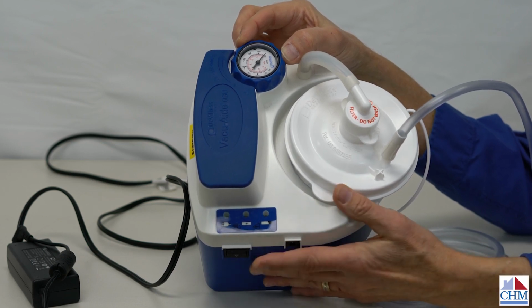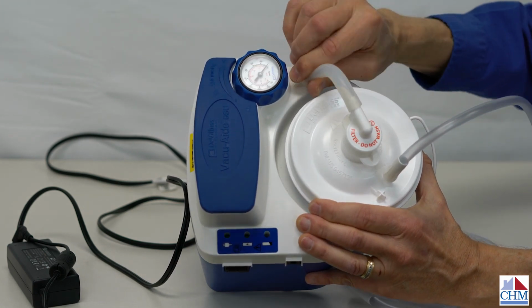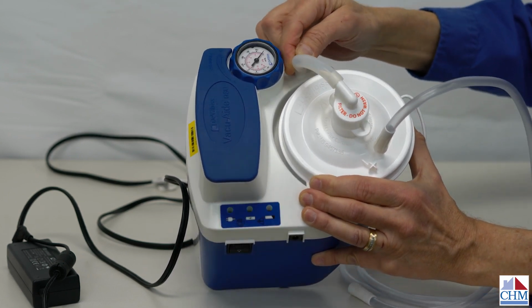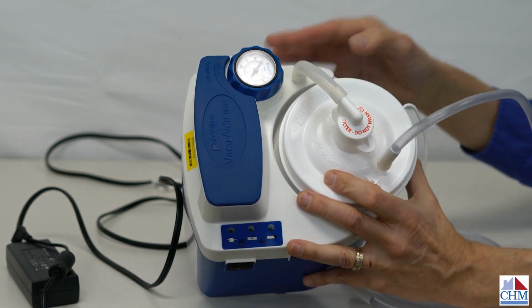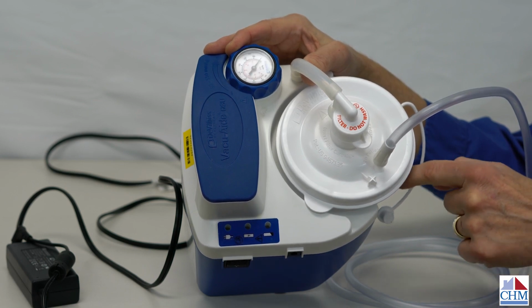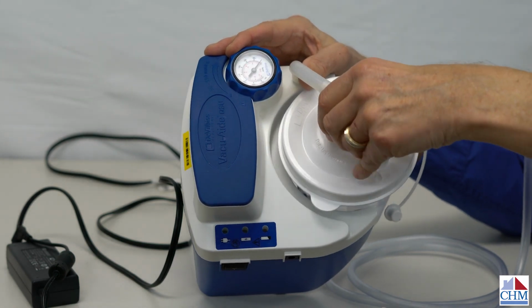Okay? The hookup of the machine, in order to get the tubing plugged in properly, is by having the short tube coming out of the machine itself where it draws the air in, plugged in there, and then the short tube goes up to the center, and this is really important, it needs to go up to the center of the canister. So what's happening is the long tube, where we're suctioning from the patient, draws moisture into the outside of the canister so that the moisture goes down in the canister, and then it draws air up through this into the inside of the machine. So here, this is a filter.